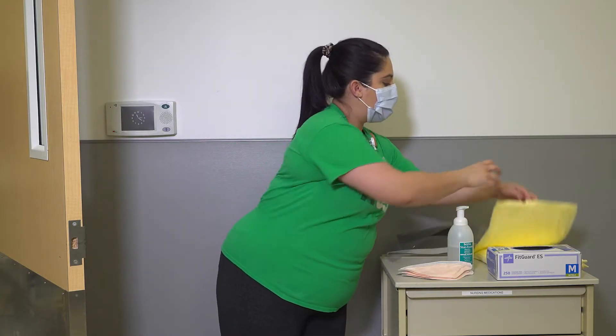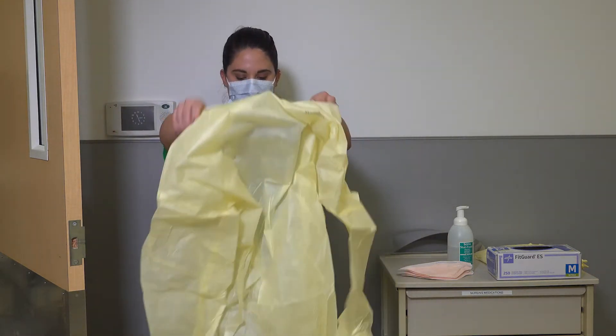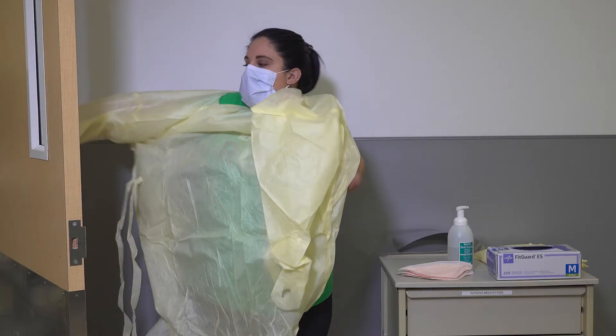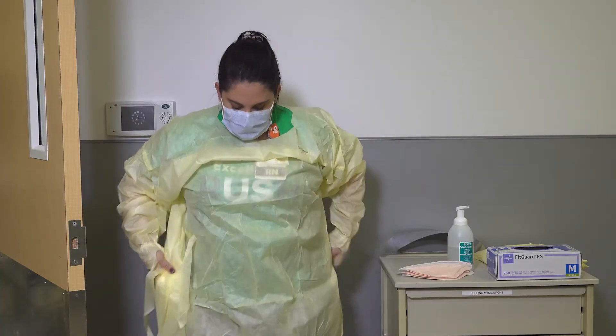Don your isolation gown. Ensure that the gown fully covers the torso from neck to knees, arms to end of wrists, and wraps around the back. Fasten the gown securely at the back of the neck and at the waist.